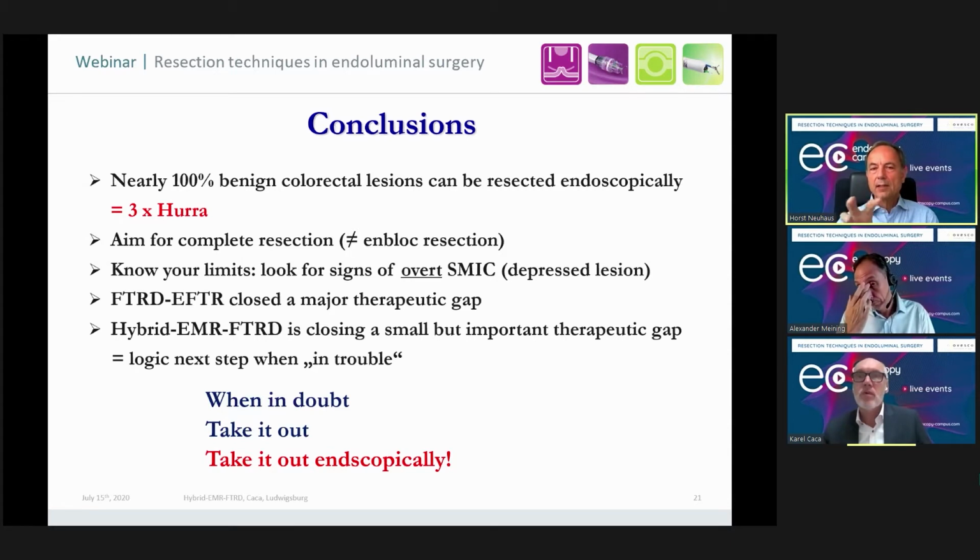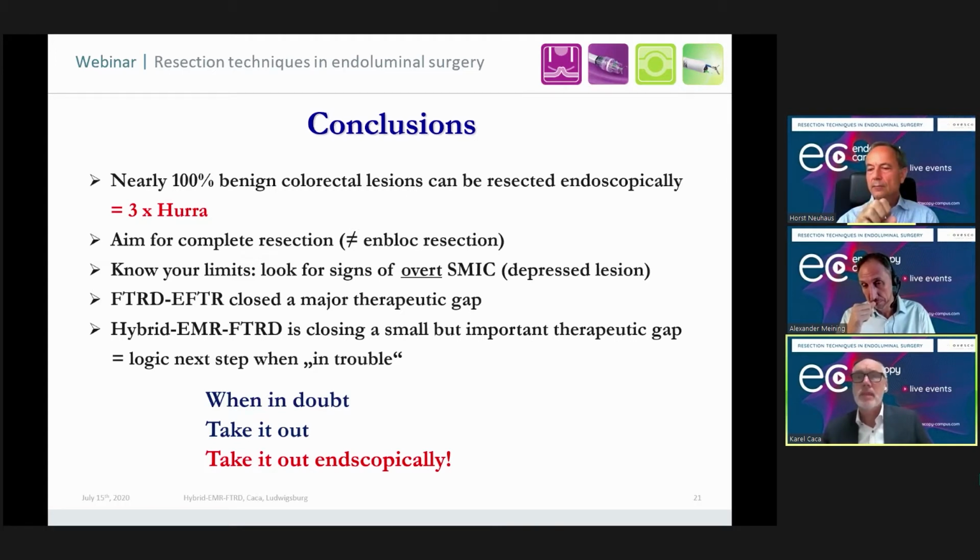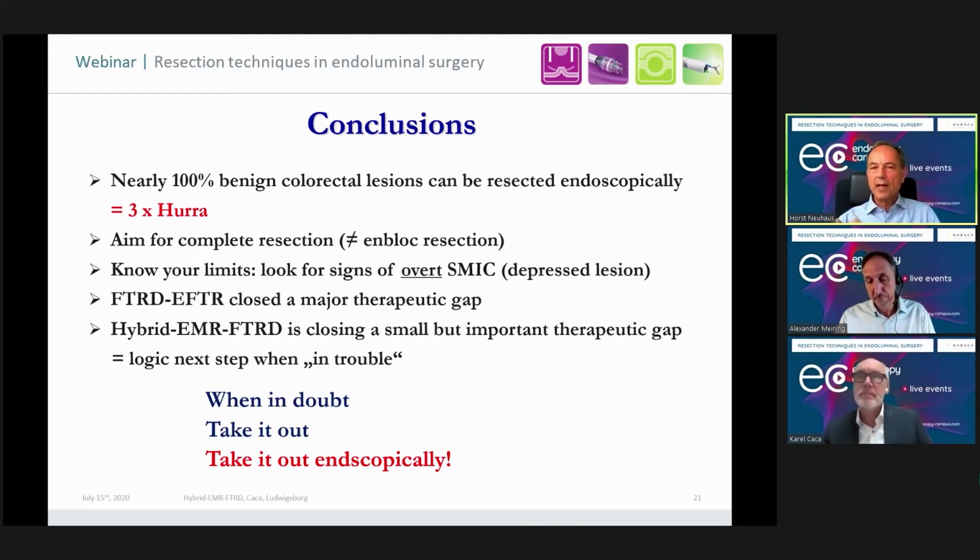You showed a case which was not too wide, but still, perforation is a possibility. It's always a possibility. But in your case, probably you attached also parts of the mucosa because you fully pulled the lesion itself, but also the resected area into the clip. But if you have a very wide resection, in the cecum for example, and you apply the clip just on the thin wall, then it may happen. At least it should be considered. And I personally think it makes no sense to do it in a second step a few days later.